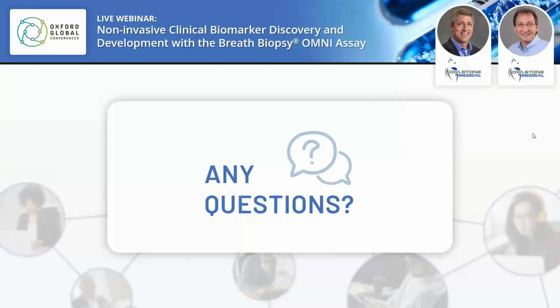Yes, you can detect RNA and DNA. The problem is, though, that you would probably require a lot more breath to do so. The amount of RNA and DNA that we were collecting, if you were to compare it to PCR-based methods to look for presence of pathogens, for example, we were very low on that curve. So we have further work to do.